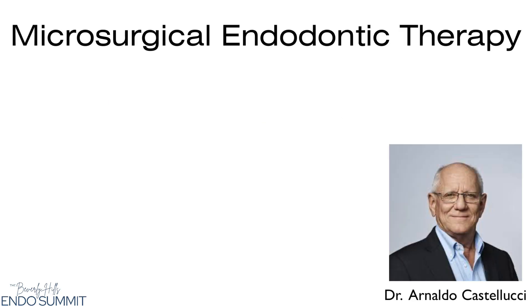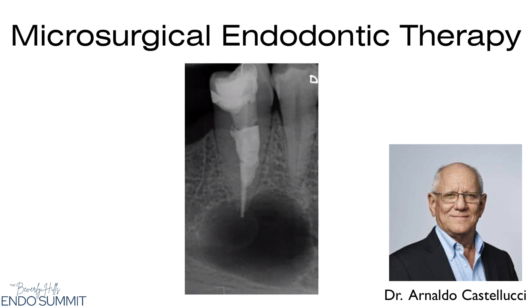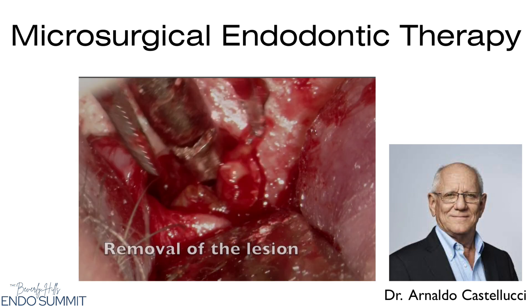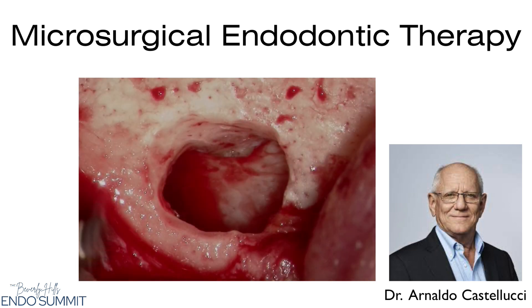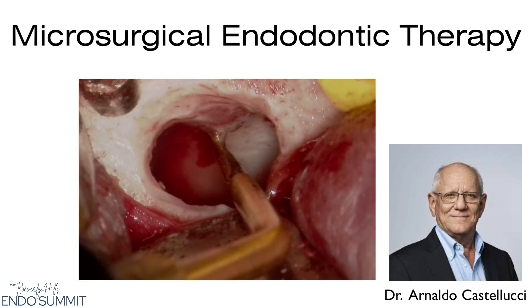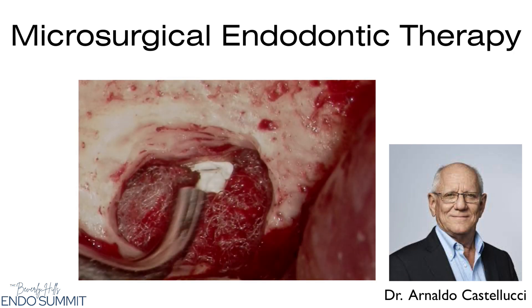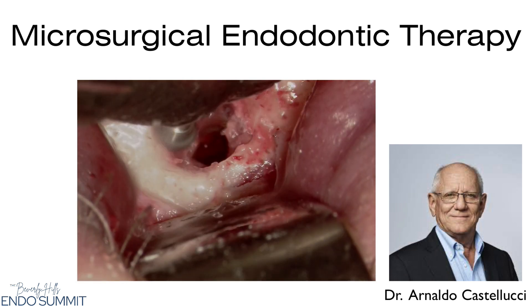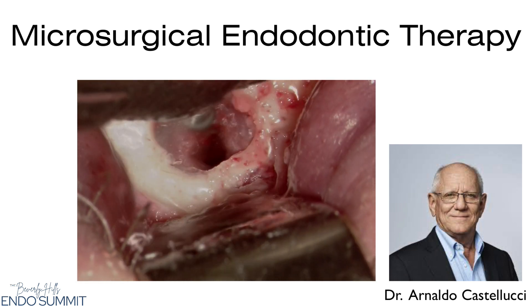In this video, you will see a microsurgical endodontic procedure by Dr. Arnaldo Castellucci from Italy on a lower right second premolar with a very large cystic lesion. That lesion is removed to have access to the root apex, then with the use of ultrasonic retro preparation, retrofill with MTA, and no use of a bone graft or a membrane — simply precise and meticulous technique.